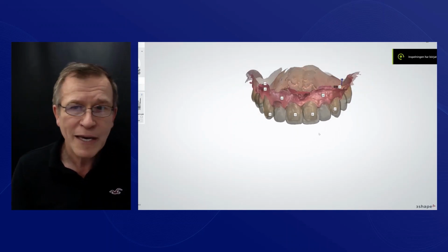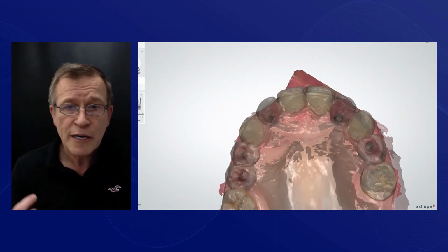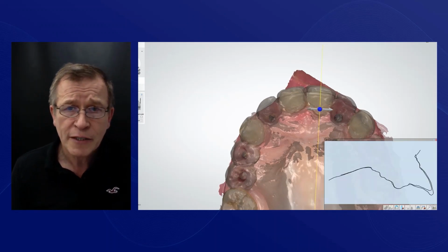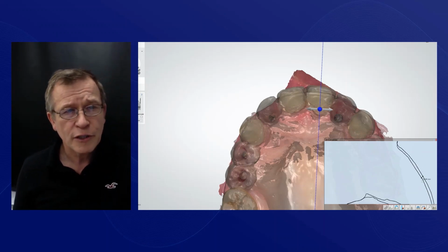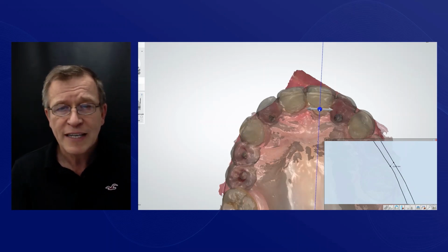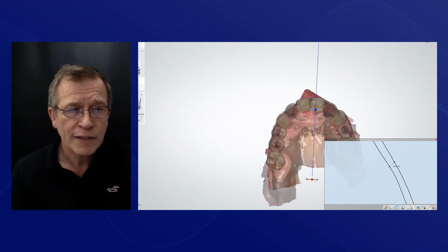This is Shemek helping me again. But we can take cross sections through the teeth. We can see where we have enough space. We can see where we need to create more space. So, I mean, it just adds so much to the predictability and the efficiency of what we do when we know exactly where we're heading for treatment. It's just a different world in there.